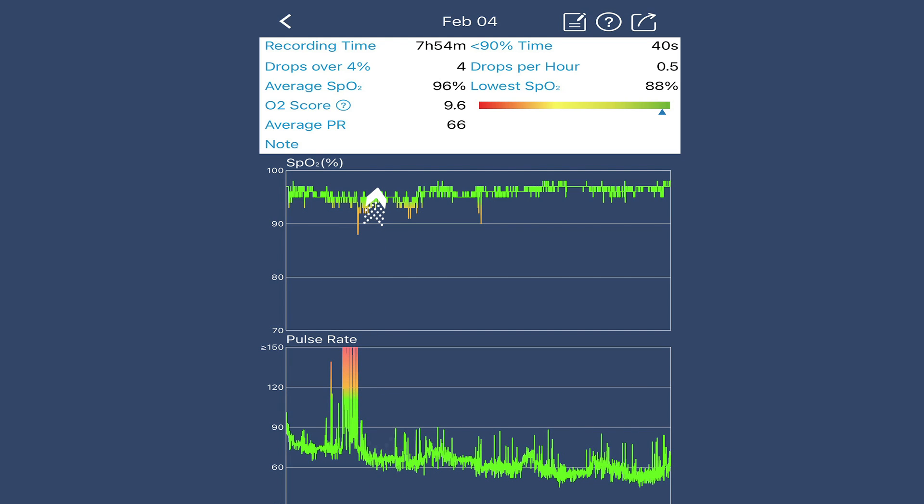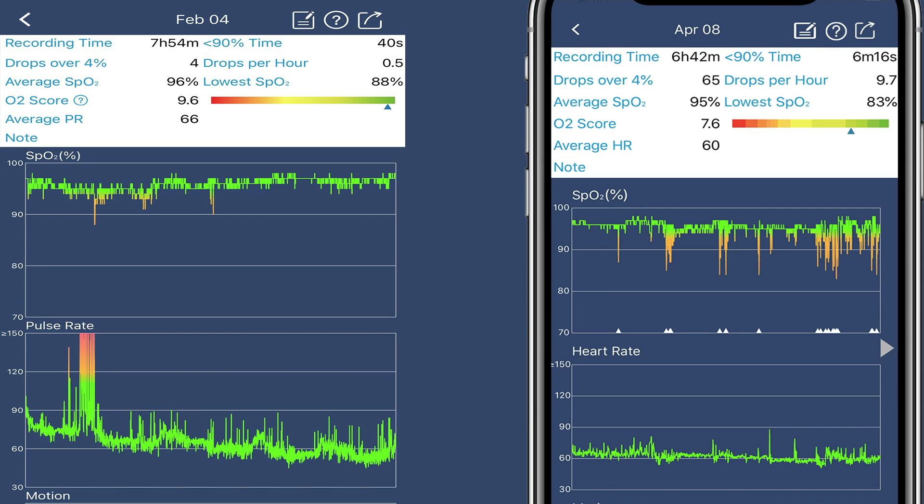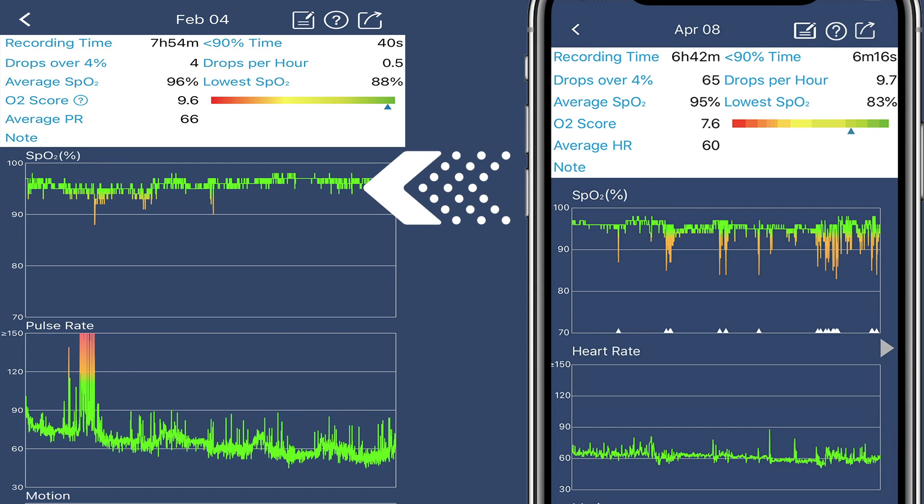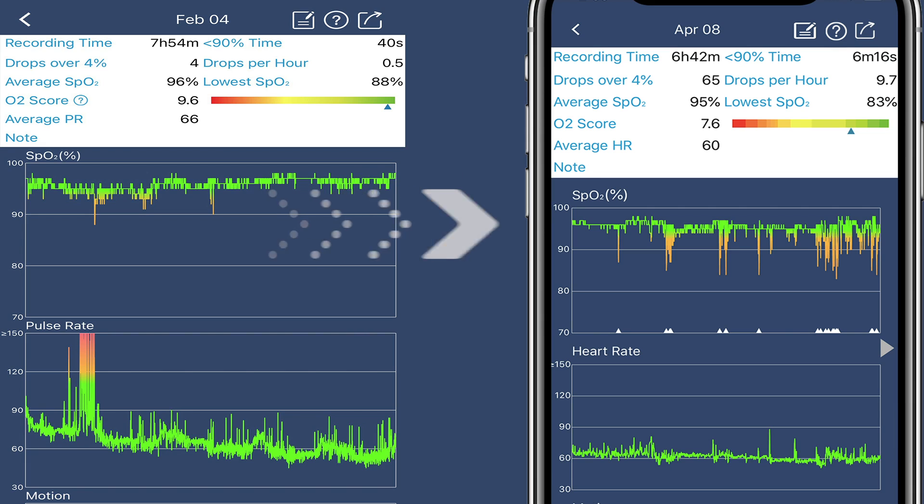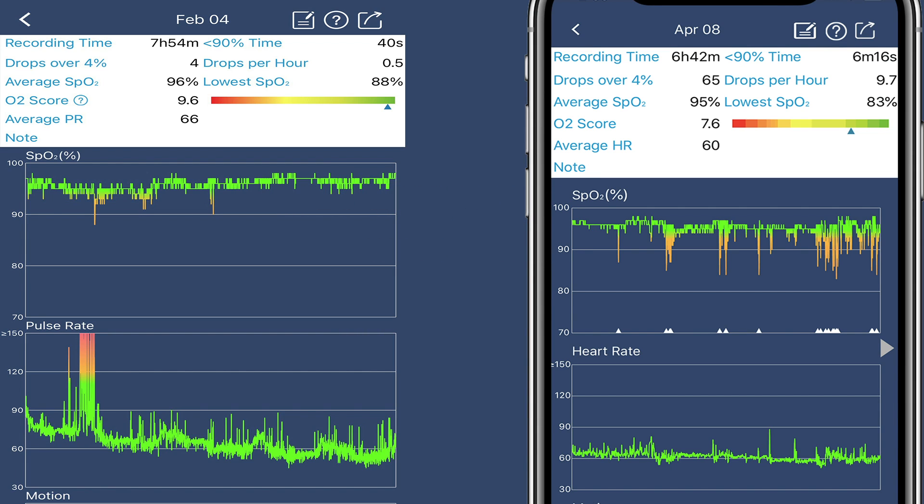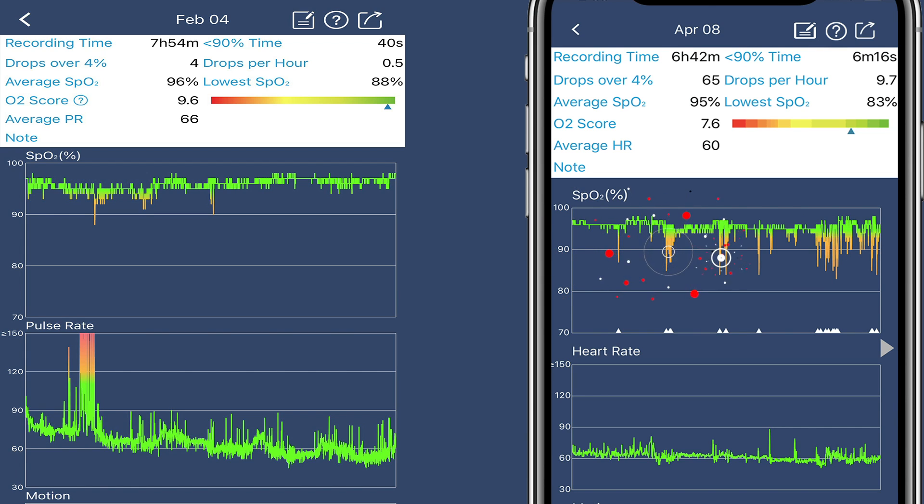All right. So let's cross now to someone who's got completely different results. So just to make it nice and easy for comparison, I have my results from last night on the left-hand side and another person's on the right. And the first thing I want to draw your attention to is with my results, obviously, with the oxygen levels, they're pretty stable. There's a lot of green bars, not many orange bars. But if we come across here to that person on the right, you'll see that there's far more orange bars happening during the night. In fact, this person had 65 times where their oxygen levels dropped over 4% compared with mine, which was only four times.